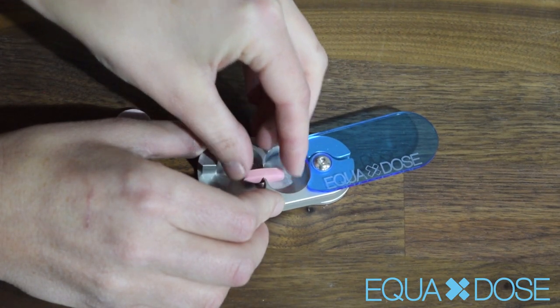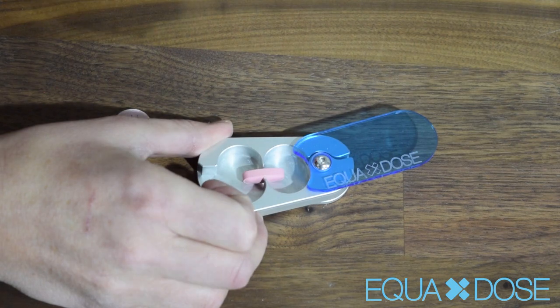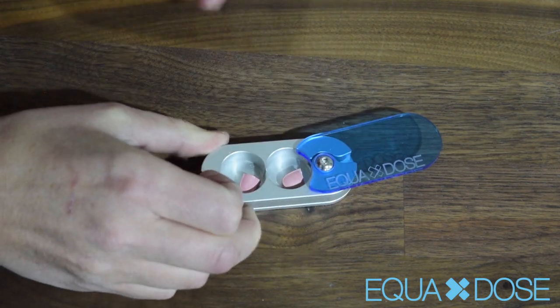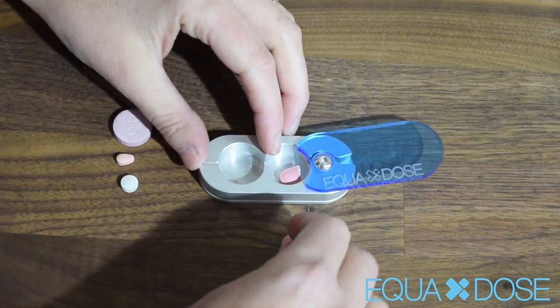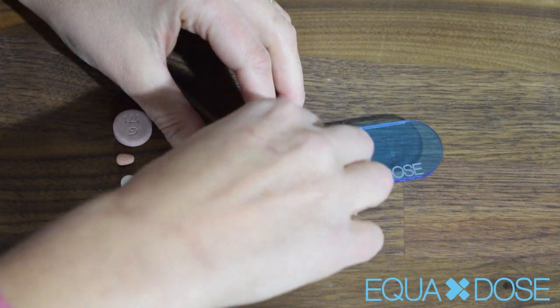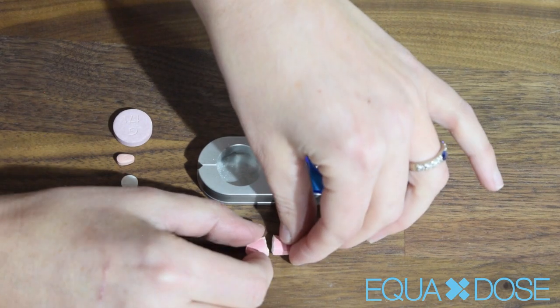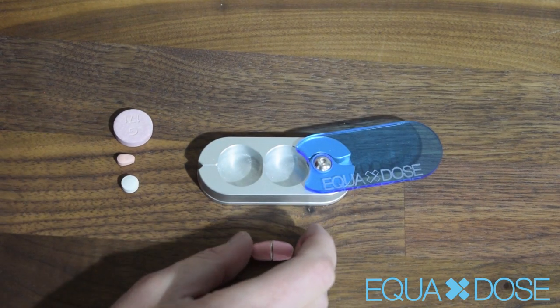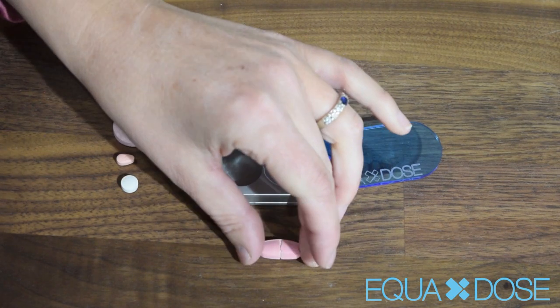Now the next step is I could close this lid now. I just like to cover it with my hands, and there you go. I'm going to show you with each of these pills how the halves turned out. Pretty good halves there. So that's the first pill.